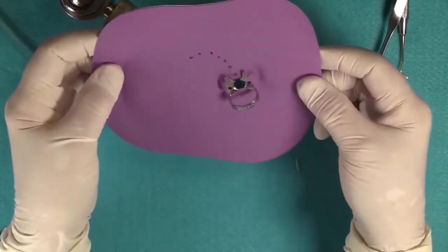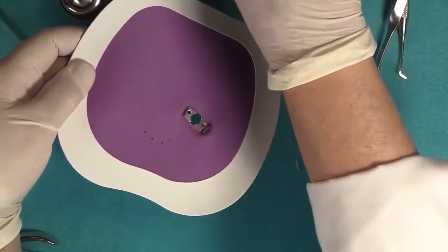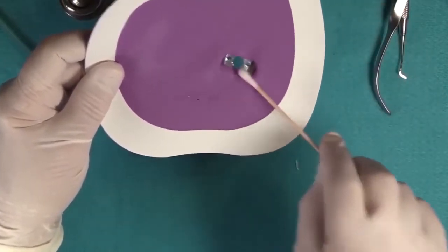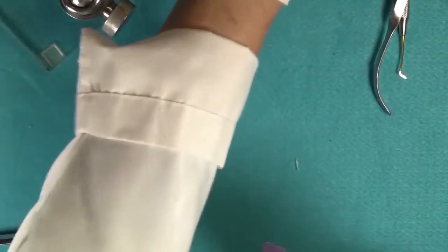Now, we do use the water-soluble lubricant on the remaining holes. What that does is it facilitates placement of the dam between the teeth. So we're going to now lubricate the remaining holes. If you were using a wingless clamp, you would have lubricated all the holes and then put the wingless clamp in. All right, so now we're ready to go to our patient.